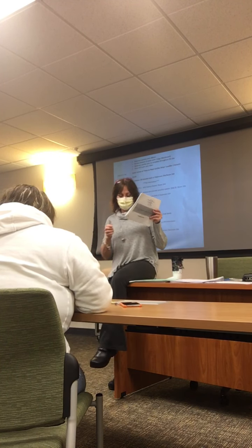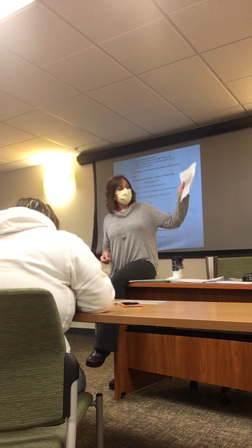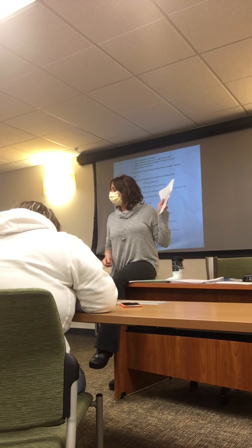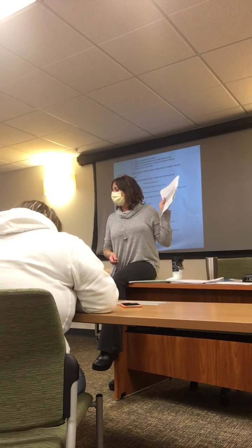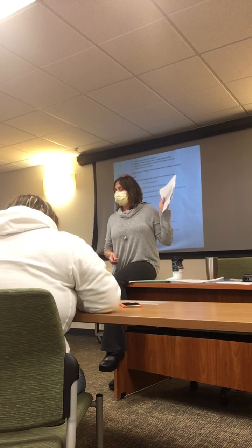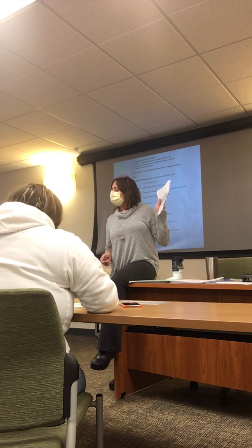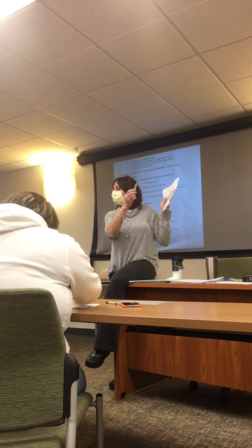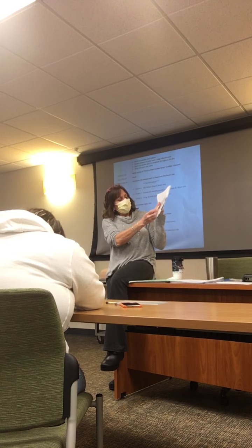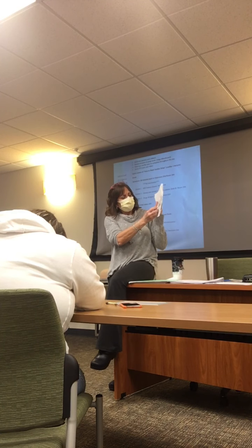So let's start analyzing this so you guys are comfortable going through analyzing heart rhythm. So look at the P's and the QRS's. Do they all look about the same? Yeah. And there is a P wave before each QRS. Good. What's my PR interval? How am I going to measure that? I'm going to take my calipers and put them at the beginning of the P wave to the beginning of the QRS complex.